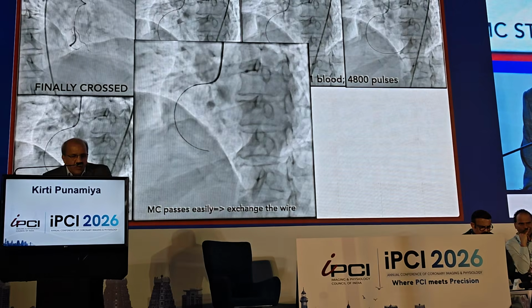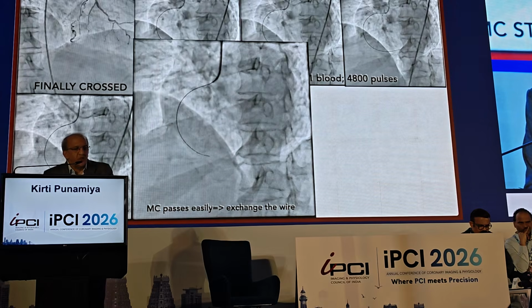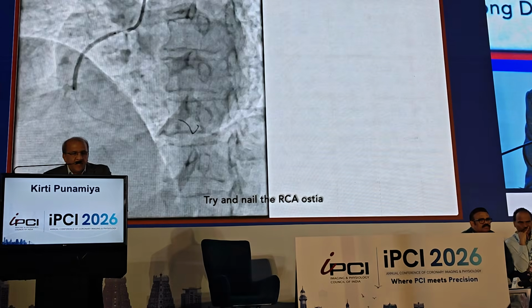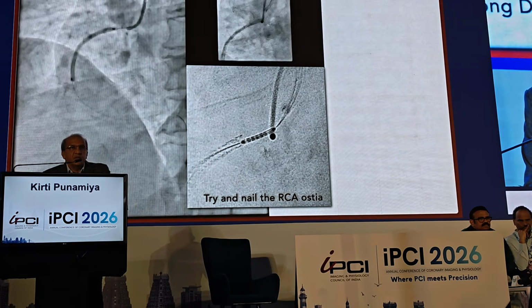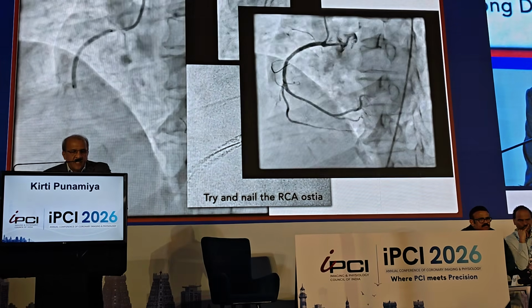And then from then on, the microcatheter passes, you get your normal standard wire in, you get an IVUS catheter in, and it becomes a regular angioplasty. We do a cut based on IVUS sizing, and once we do that, stents, making sure that it's right at the ostium, using diagnostic catheters to identify the ostium while we are doing this, and then this is our final result.